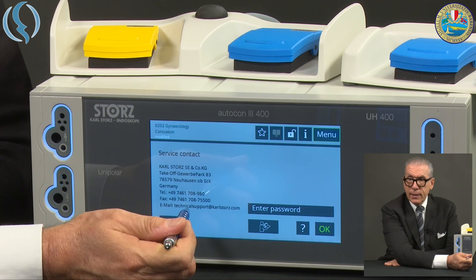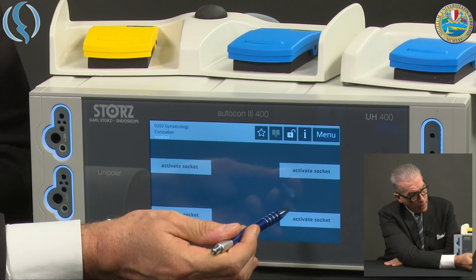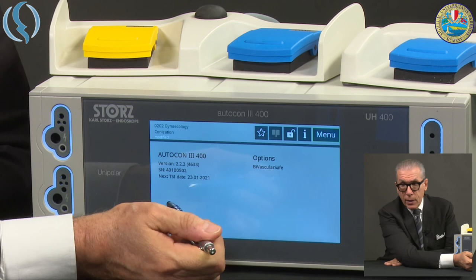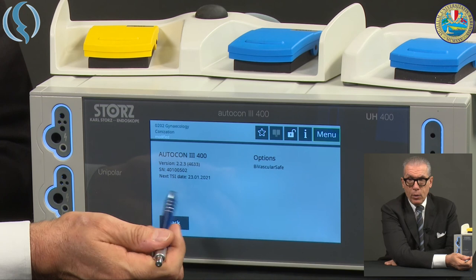Finally, the last two options: Service gives you the possibility to access the internal system of the device, but it is reserved for CalStorz technicians. System Information tells you which version of the system is available on the machine. And these are all the menu options. Back, and you are in the main screen.